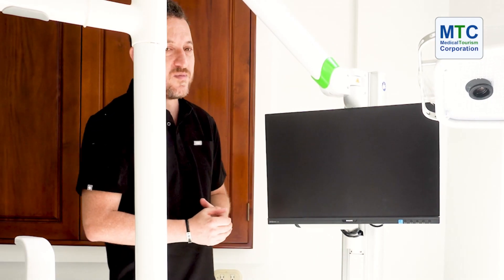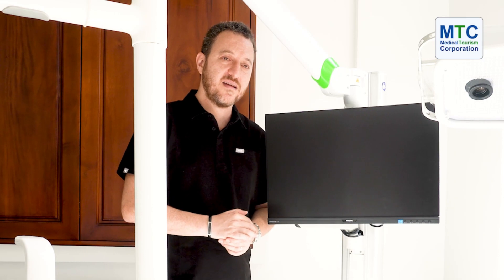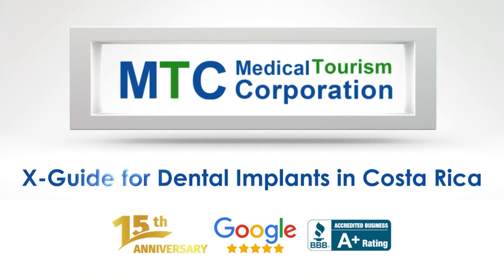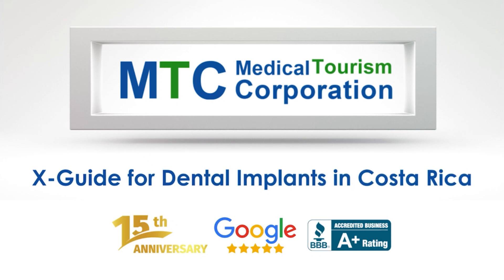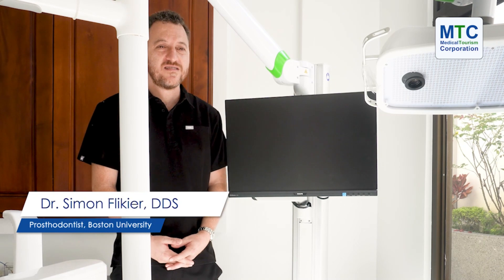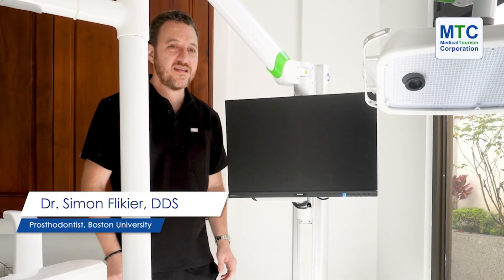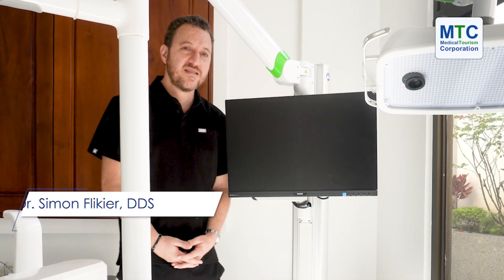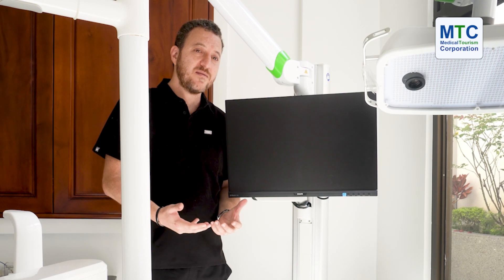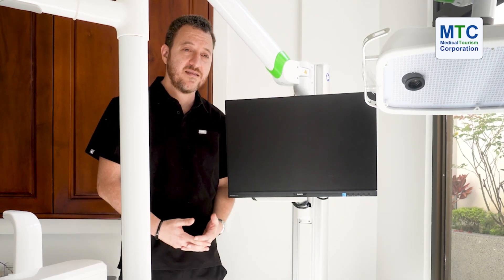Hi, I'm Dr. Flikier from Flikier Dental Institute and I want to introduce you today to the X-Guide. The X-Guide is a machine that helps us place implants through a digital guide.